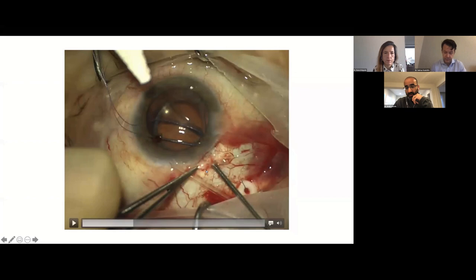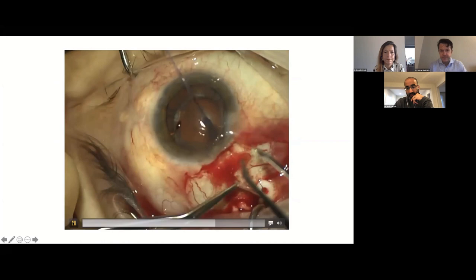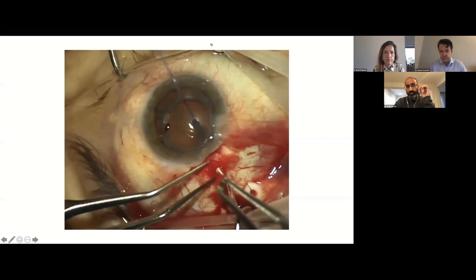And that gives you a little bit of a lip to get the tip of the bevel tube into the tunnel so that it goes in a little bit more easily. So I'll play that here so you can catch it. And then at this point, the tip is going to start swiping here to the side. It's just teasing away a little bit of the sclera to create a little bit of a flap. See that there? So I think for trainees who are first starting, the tube goes right in every time when you do it that way. It's just a point that I think is very frustrating for trainees, and that's one way to fix it. Won't be an issue if you can do it that way.